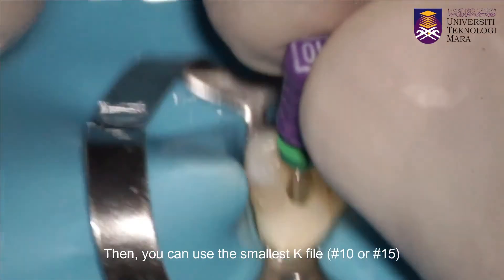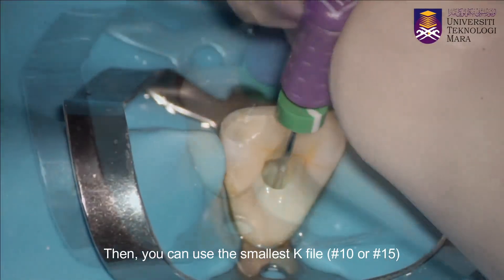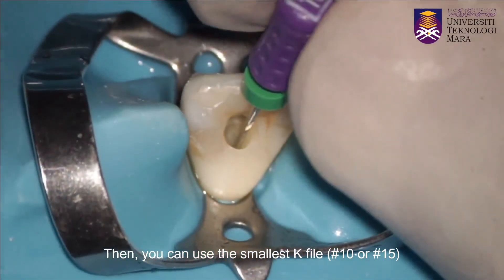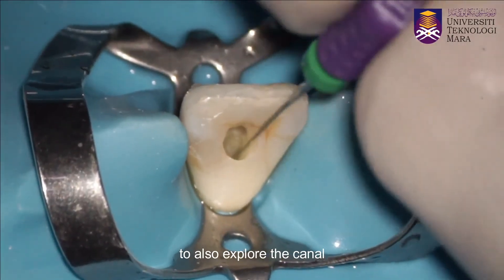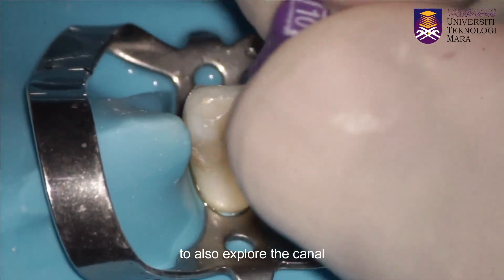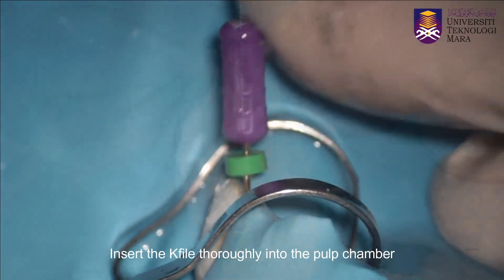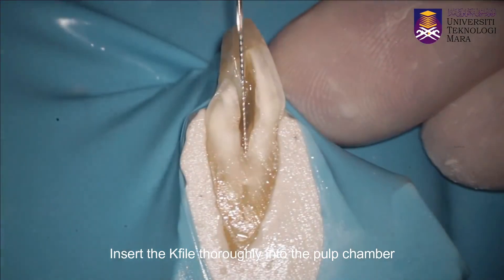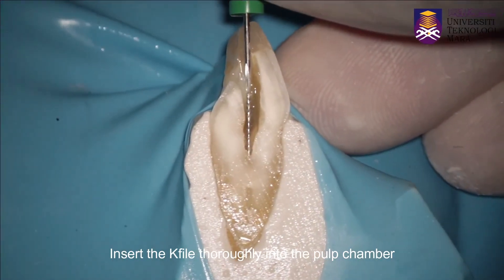You can use the smallest K-file, which is size 10 or 15, to explore the canal. Insert the K-file thoroughly into the pulp chamber.